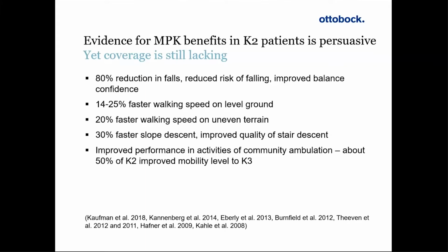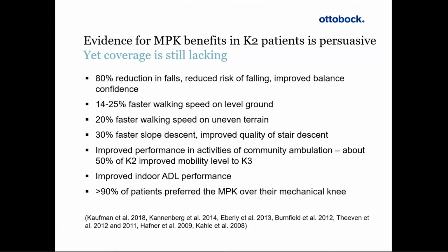About 50% of the K2 patients that have been enrolled in microprocessor knee studies were able to improve their mobility level to K3. Which is a really good sign. Studies have also found improved indoor ADL performance, so especially around self-care and being able to live an independent lifestyle. And as far as preference is concerned, more than 90% of the patients that were enrolled in microprocessor knee studies in the end preferred the microprocessor knee over their previous mechanical knee.